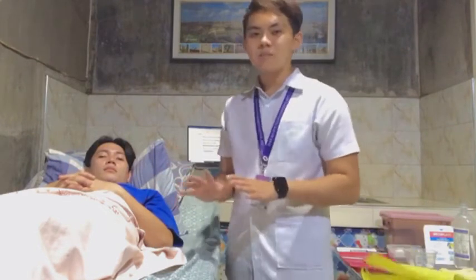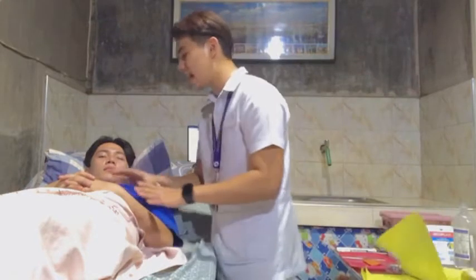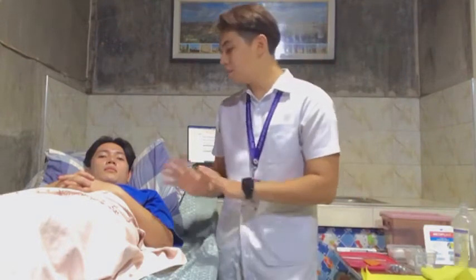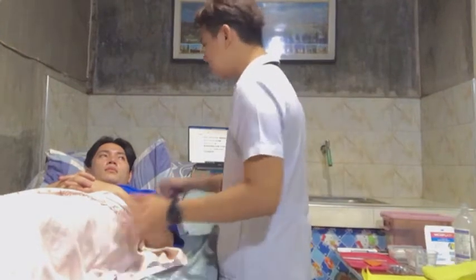So next is we need to determine which sites we'll use. The sites where the skin appears to be healthy and free from irritation and inflammation reduce the discomfort of injection. So the site is, of course, the abdomen of the patient. Of course, after that, shift the patient's bed, then expose only the potential injection sites and inspect the area for bruising, inflammation, and edema. Okay, sir, can you please adjust?